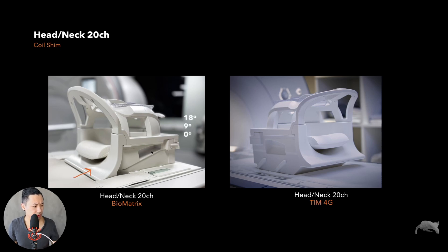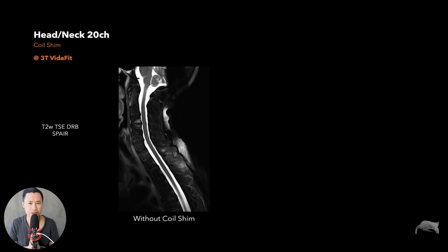The main difference between the two is the angulation feature — you can angulate it in two or three notches, making it easier for patients with very angulated necks. The other key difference is the coil shim right here. This part is very good for better homogeneity, better head neck imaging, and better spine imaging.